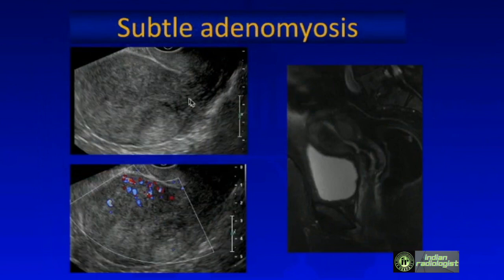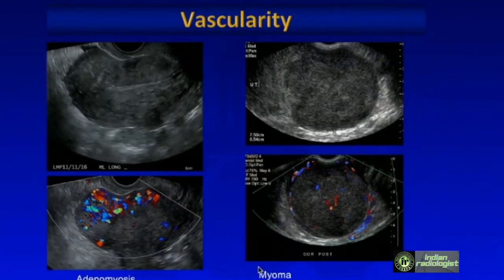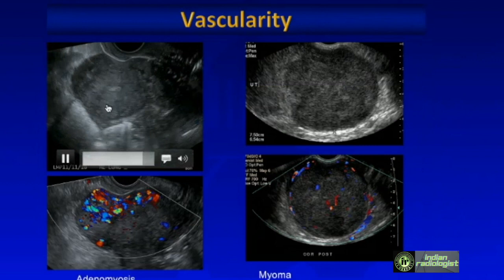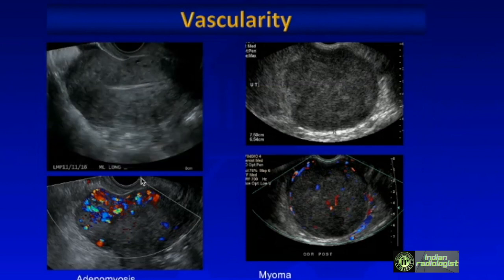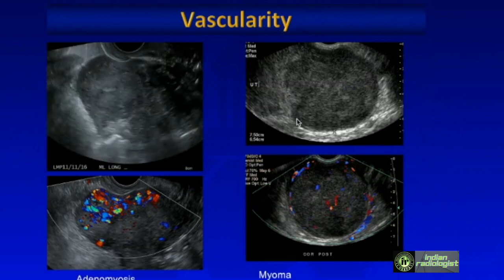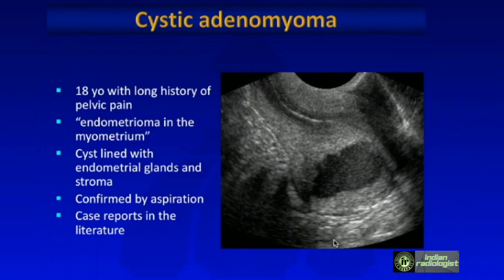Here is a more subtle case showing asymmetric thickening of the myometrium with echogenic areas. You can see the penetrating vessels. To contrast the vascularity of adenomyosis — penetrating vessels in the myometrium — versus myoma, where vascularity is displayed surrounding the lesion.